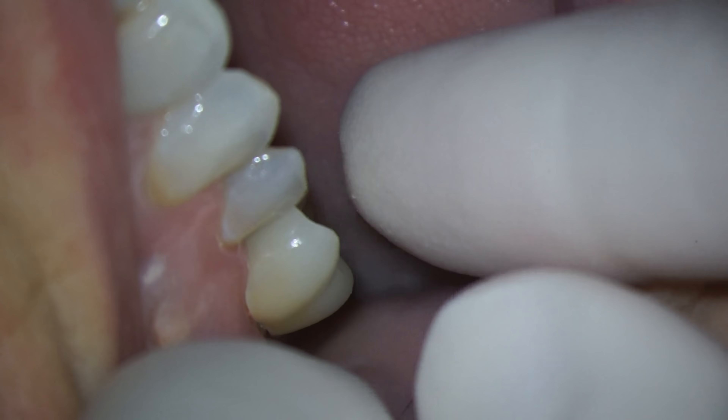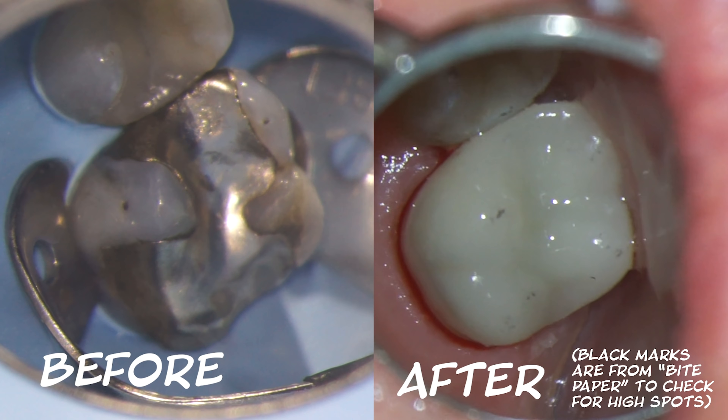Then we get the crown back from the lab, try it in, and cement it. We can kind of see the difference from before and after.